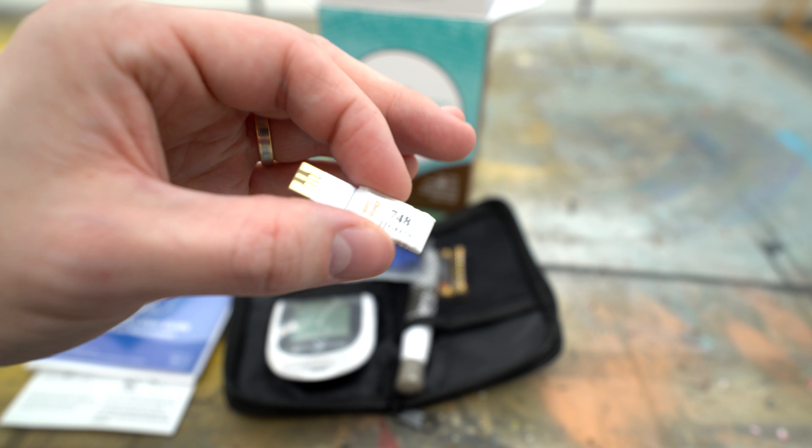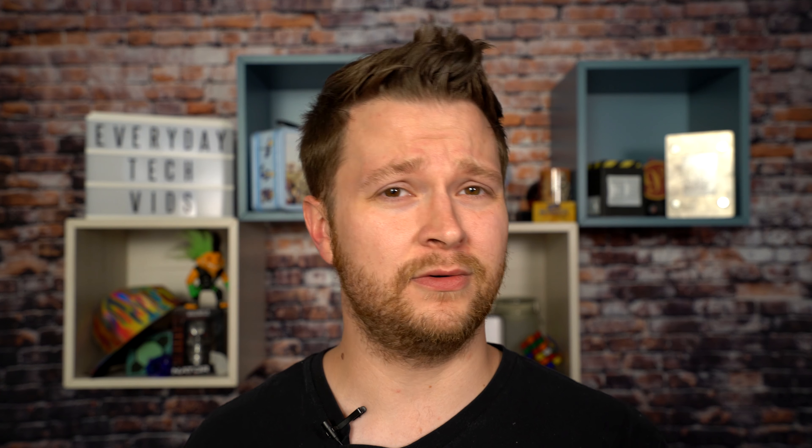One other thing I found — and I actually had to look this up to see what it was for — was what looked like a testing strip, but it had a bigger back end on it that looked like some sort of microchip. After reading through the instructions, that is actually for the meter itself. Before you start using testing strips, you have to plug that into the meter and it helps sync with the testing strips, so you'll get a much more accurate reading if it knows more data about the specific strips you're using. So when you start using a new set of strips, make sure to sync that first.